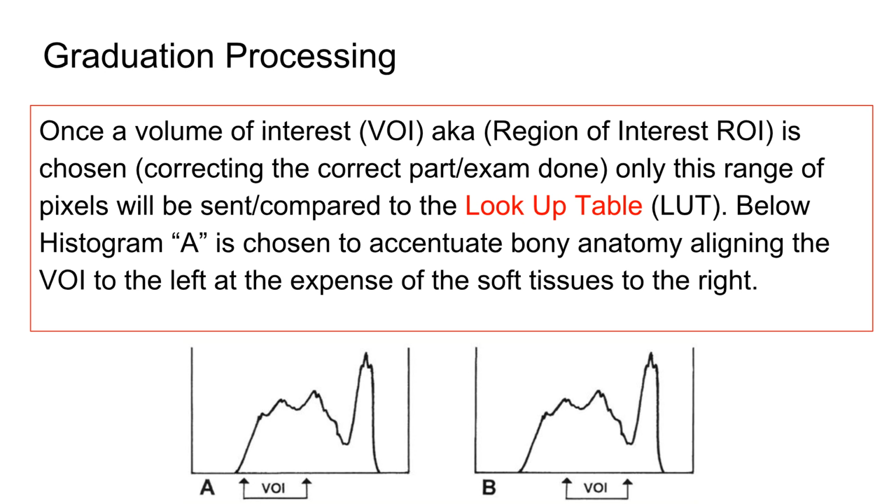Yeah. So what about when you send an image somewhere else? Is that post-processing or just? When you send the image into PACS, or what is that process called? I'm not sure if I understand the question, but I can tell you that your image has to be transmitted from your workstation and then kept somewhere, right? Because radiologists want to read in their little room. They don't want to come down to where you are.